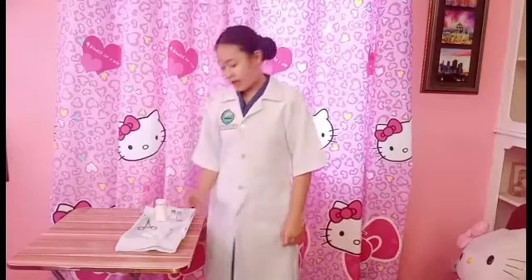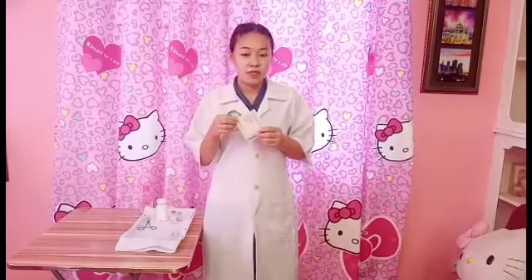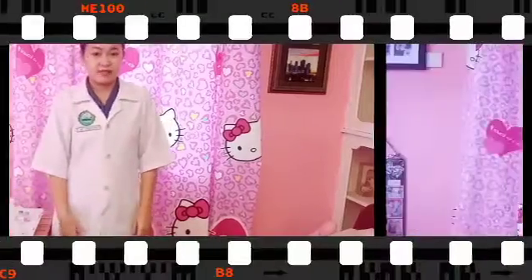Next is to assemble equipment and supplies. The equipment and supplies that we need are a vial or ampule of the correct medication, a sterile 1 ml syringe calibrated into hundredths of a ml, a 25 to 27 gauge needle, 1/4 to 5/8 inch long, an alcohol swab, a 2x2 sterile gauze square, a band-aid (optional), and epinephrine.